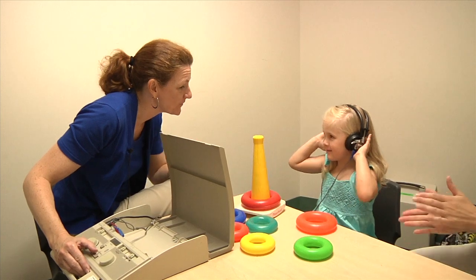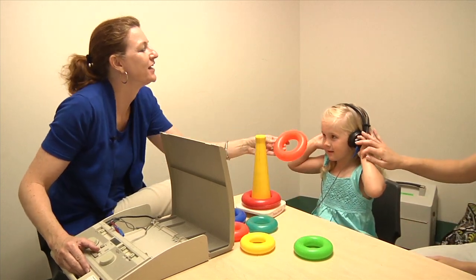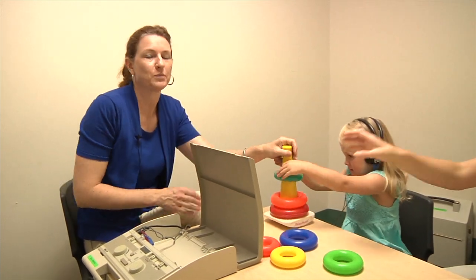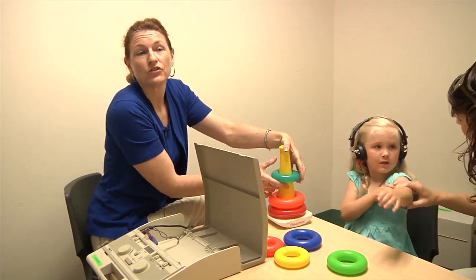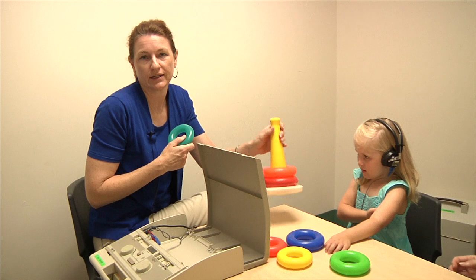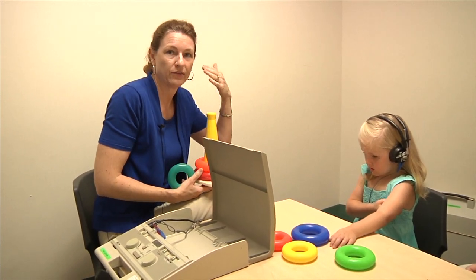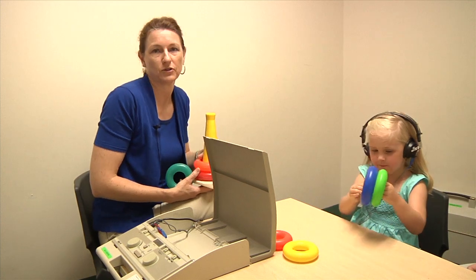You heard a beep, didn't you? Okay, let's try that one. Okay, so that would be another kind. Now, this one was a little bit distracting for her, so you want to find something that's interesting enough to keep their attention, but not so distracting that the game itself stops them from responding.